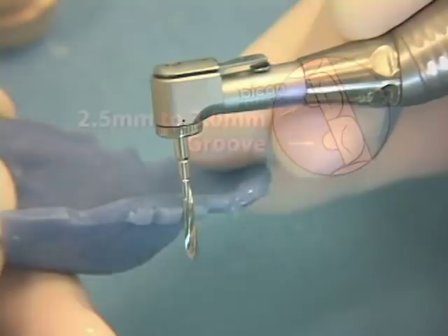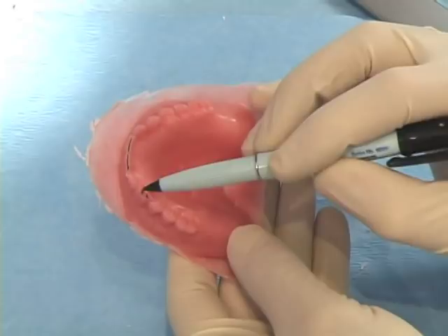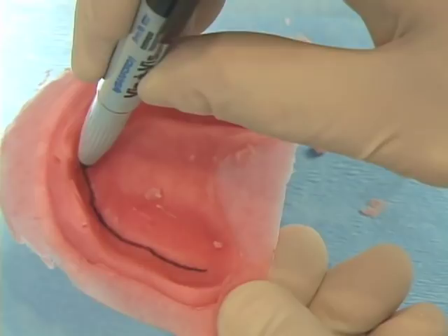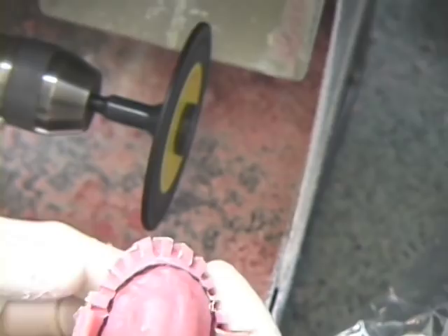When using an existing or duplicated prosthesis, draw a line on the occlusal aspect of the prosthesis bisecting the incisal edges and central fossa, and another on the alveolar ridge side of the prosthesis corresponding to its greatest concavity. To afford better visibility for the surgeon, the buccal aspect of the prosthesis is removed to the level of the central fossa or incisal edge and to the line corresponding to the greatest concavity of the alveolar ridge side of the prosthesis. The incisal slot, slightly wider than 2 millimeters, is made in the long axis and center of each tooth, which will act as a guide for the pilot drill.